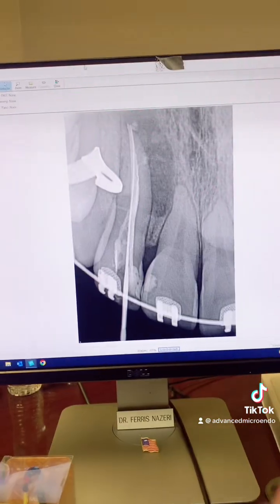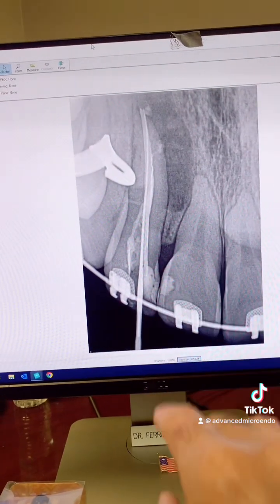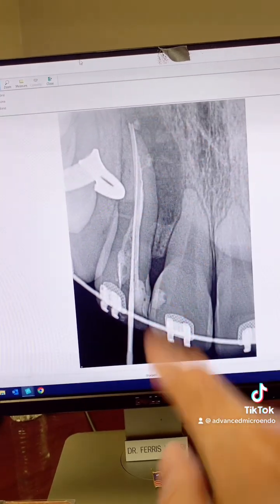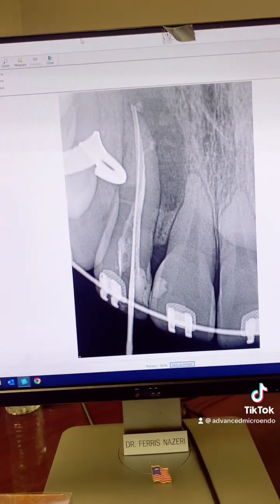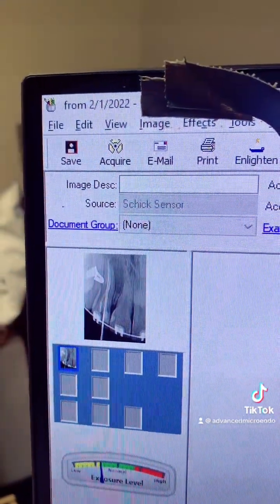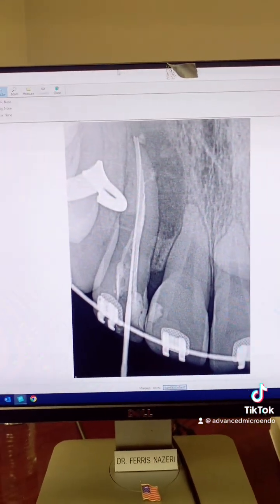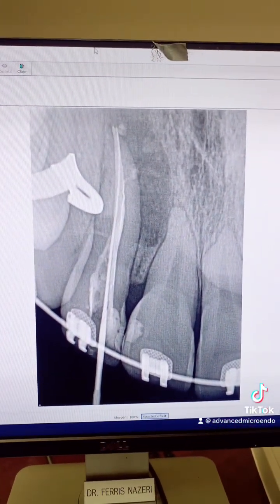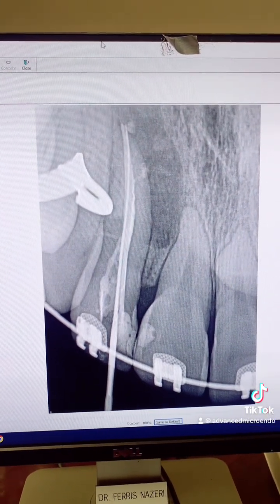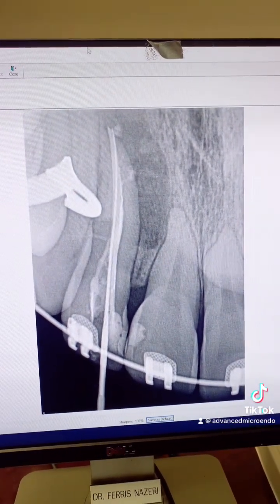So take a look. We went ahead, as I said, a year and a half ago and started the endodontic retreatment. This is my working length PA X-ray. And here's the date. I couldn't finish this root canal in one appointment. A lot of you ask me, what is my criteria for doing multiple-visit endodontic treatment or retreatment? If I can't get the canal dry right before obturation.